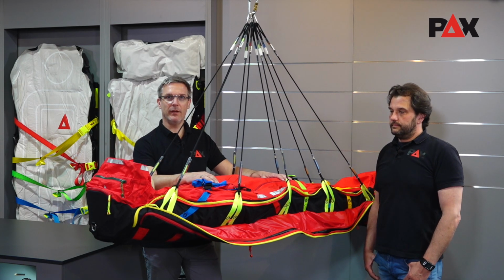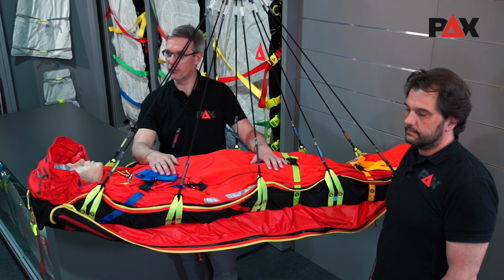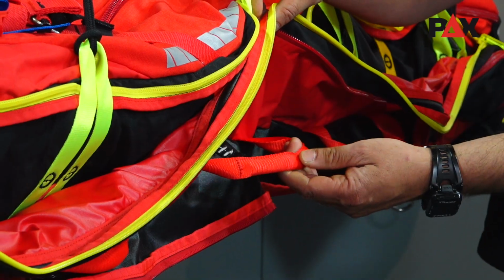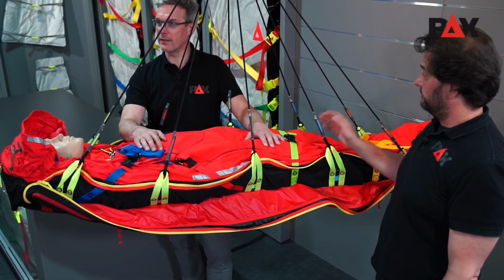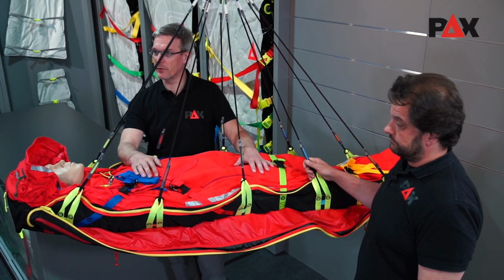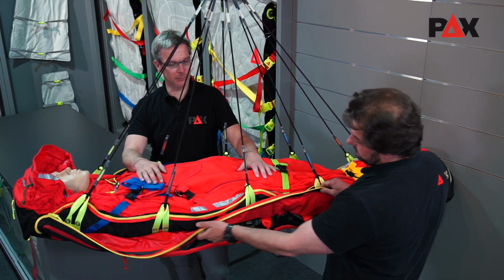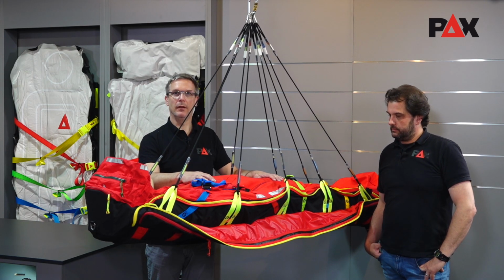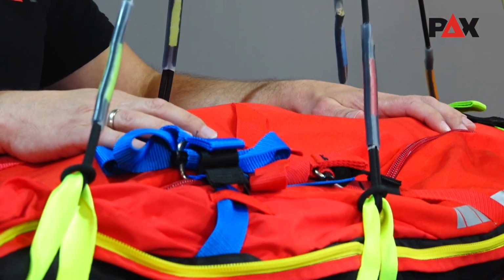With the rescue bag, the patient can be carried by a person using the integrated hand loops in the side compartment marked in red. Niels is showing it. Or the patient can be transported by the winch of a helicopter as external load, for which the pre-installed harness in the yellow marked side compartments is used. Or C, be transported by a rope-assisted rescue system. The patient can then also be transported in all rescue systems like trucks, boats, helicopters or airplanes.